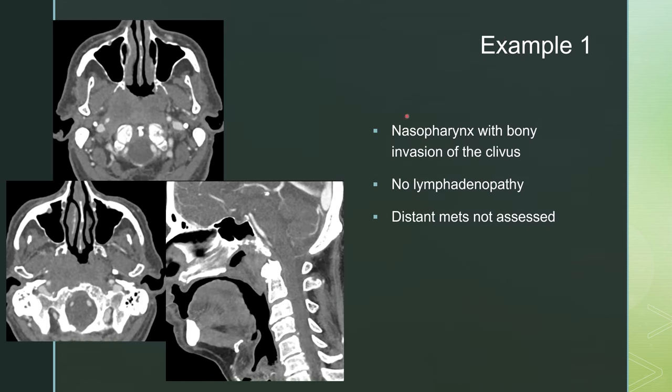Example one: you can see a large soft tissue mass filling the nasopharynx, a little asymmetric to the right. Here's the pterygoid plate and the carotid space, with soft tissue extending into that carotid space. Key things to look for are erosions of adjacent bony structures. Here you can see erosion of the cortex of the clivus — irregularity, lucency, and erosion of that cortex with soft tissue extending into the sphenoid sinus.